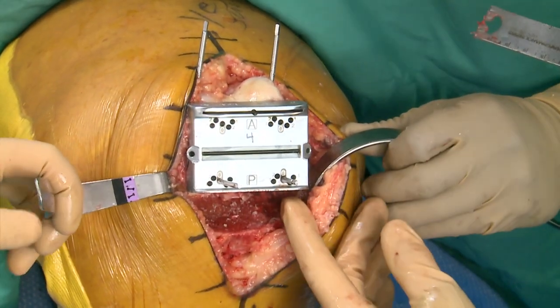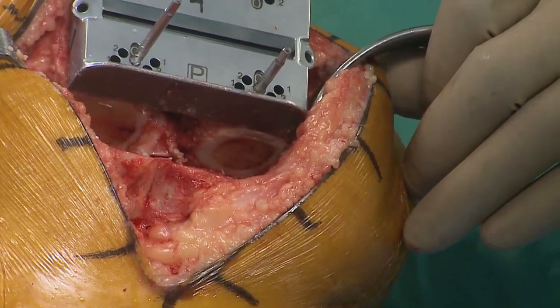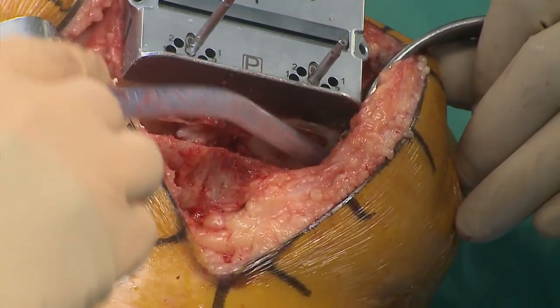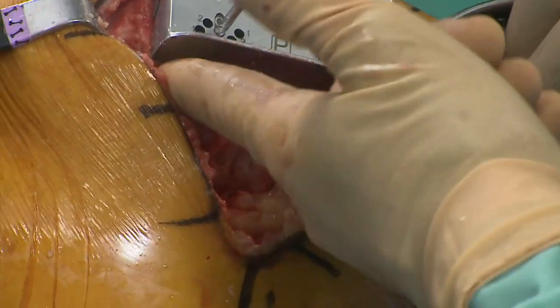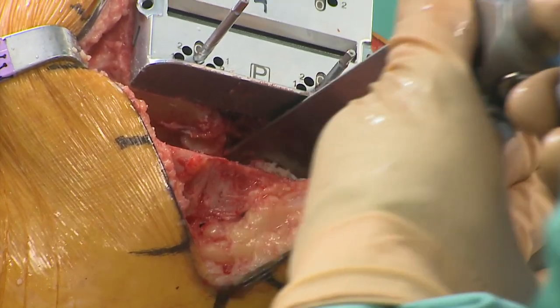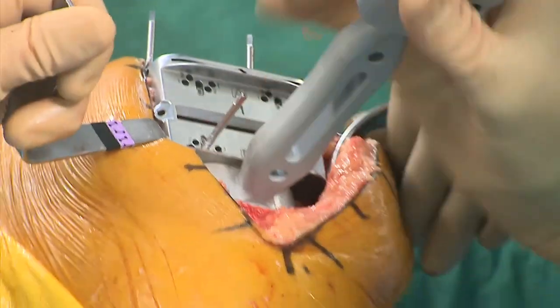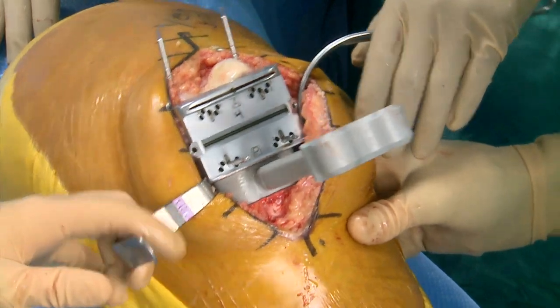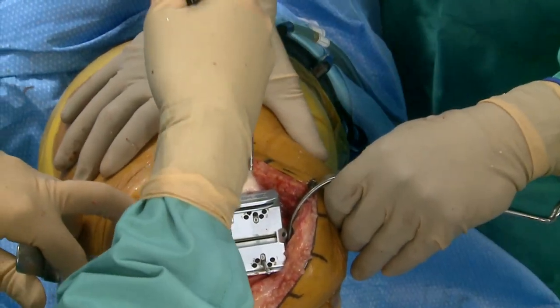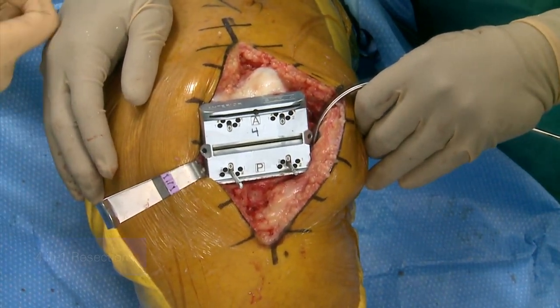The resection on the lateral side was just a few millimeters — kind of a skim cut. If I were doing purely measured resection, the distal femoral cut came out to 10 off the medial and nine off the lateral, so I'd want that same ratio here. But I think I would not be balanced. So this is just a skim cut on the lateral side. I'll now confirm that the 13 is what I want and that we're matched, then pull out the femoral pins since I know I'm not taking anything more off the top.